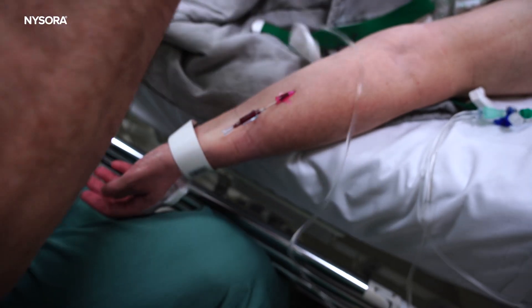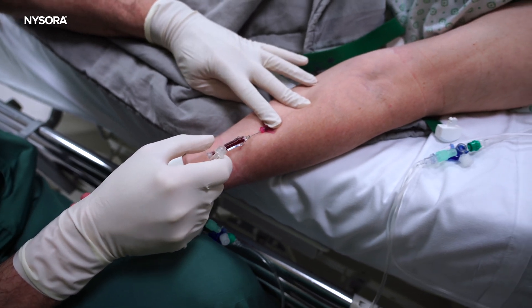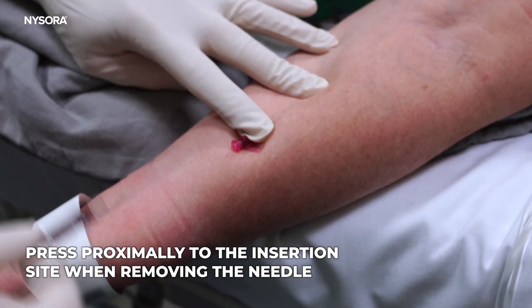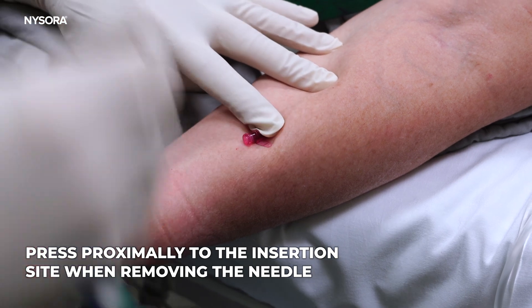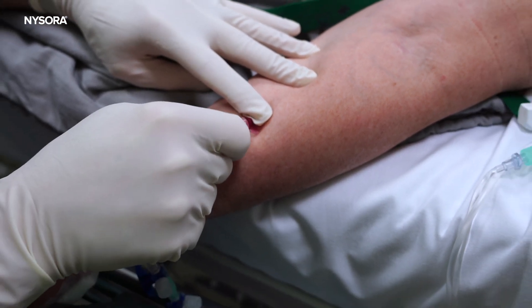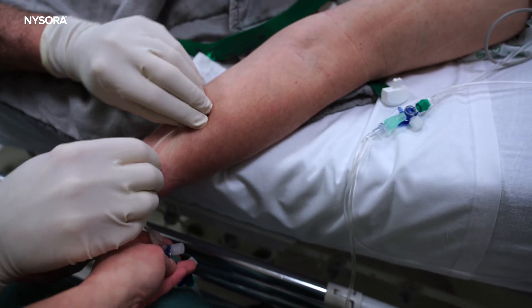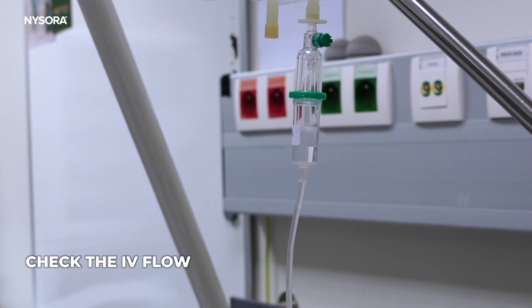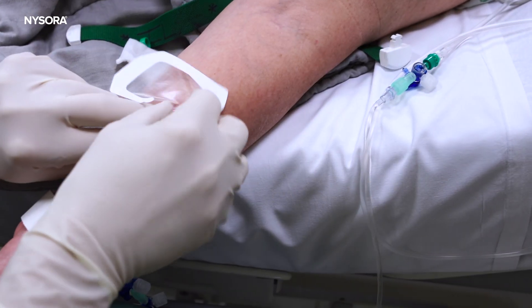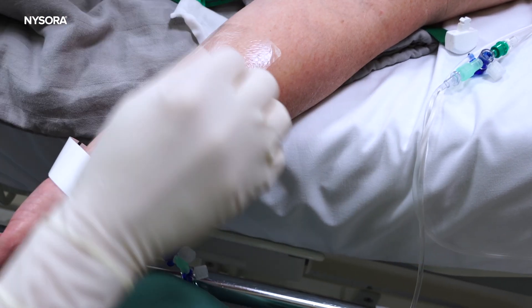Release this. Press proximally so we don't create a mess on the bed. Attach — and here we go. A deep vein with a 20-gauge catheter that works. Very nice flow. Here we're going to tape this. And that was it.